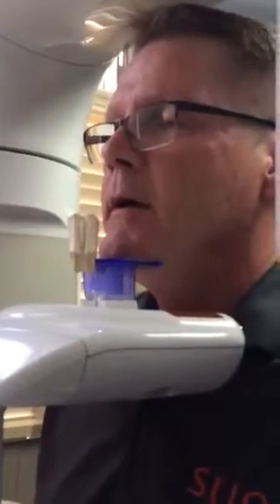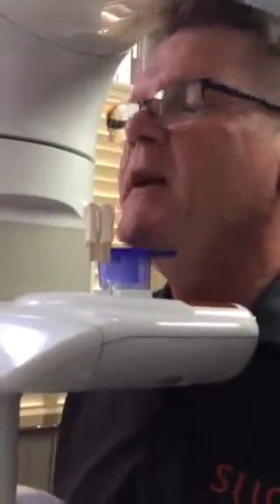Yes. Press and hold. It always starts a little slow. And the idea is, there'll be more. That's pretty good. There's more information on optimal patient positioning and how the resulting image should look, with a nice little smile versus a frown. The smile is that the head isn't too far back, that your neck is straight.